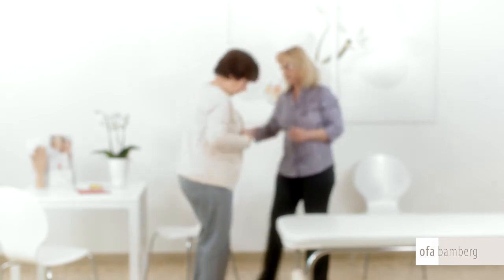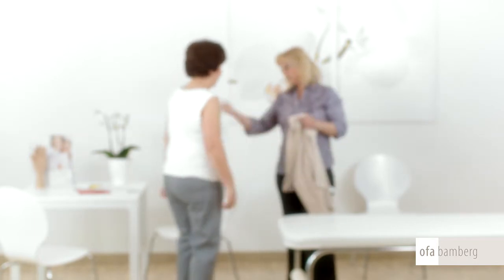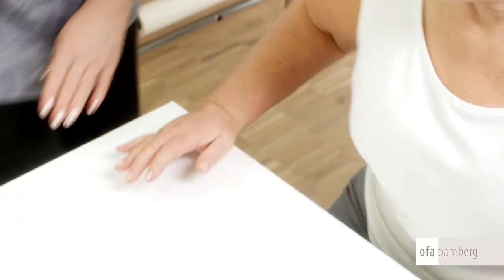Explain to your patient right from the beginning the individual steps and the approximate time involved in the measuring process. The patient will then not become impatient about the time required. When taking measurements, the arm should rest on a surface, for example a table.